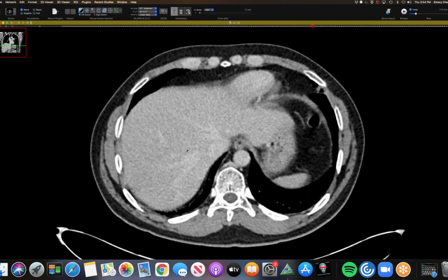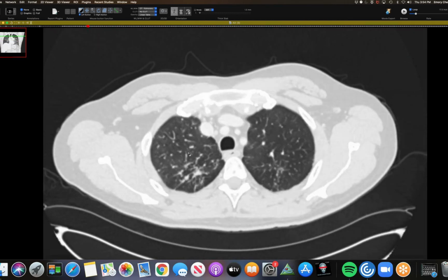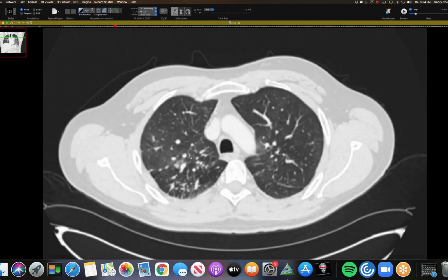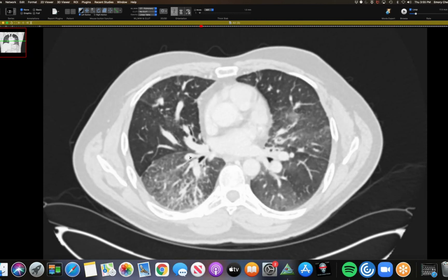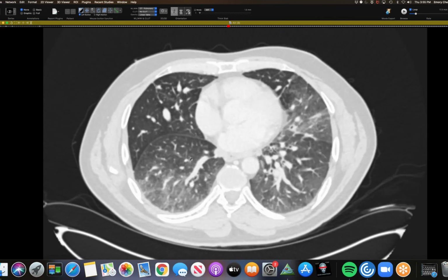I think there is dust disease, because when he showed the upper lobes, there are perilymphatic nodules, but typically nodes with silica, that's silicosis. I buy that, no problem. It's the central and vascular stuff I don't like. Sarcoid, what do you think about sarcoid? Yeah, or sarcoid. He's entitled to have more than one disease. So yes, he's been a miner, but I think he's got sarcoid or an infection on top of that.